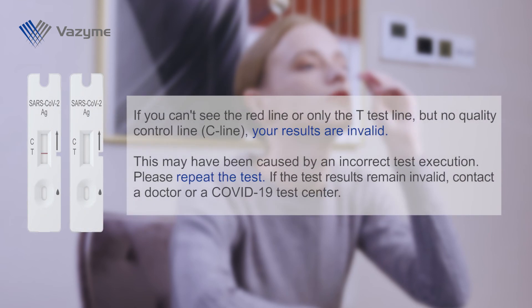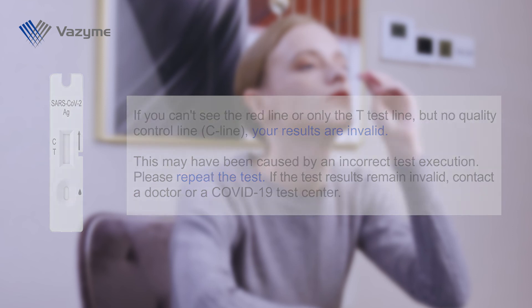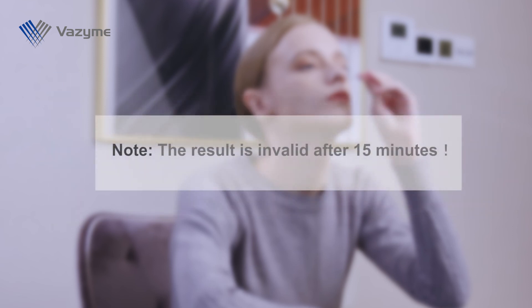If you can't see any red line, or only the T test line but no quality control line (C line), your results are invalid. This may have been caused by an incorrect test execution. Please repeat the test. If the test results remain invalid, contact a doctor or a COVID-19 test center. Note: the result is invalid after 15 minutes.